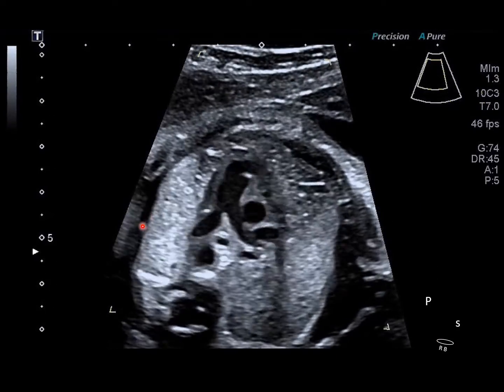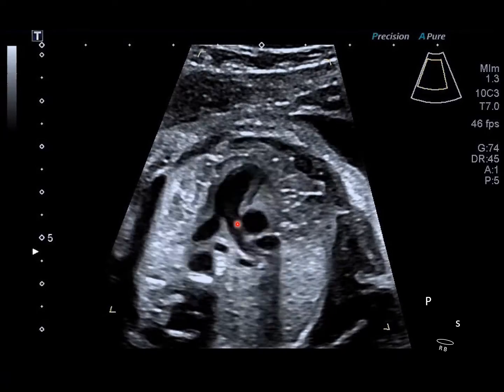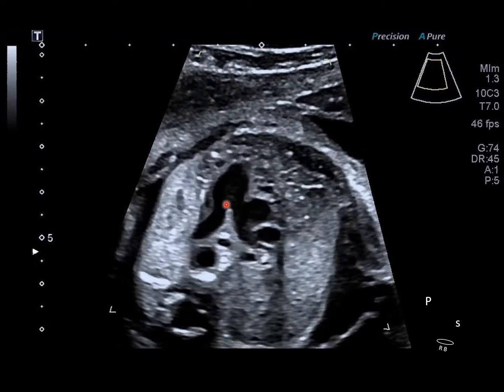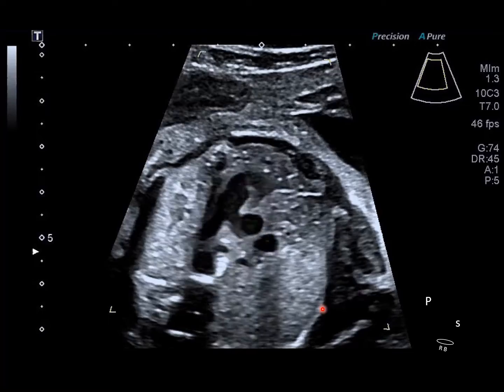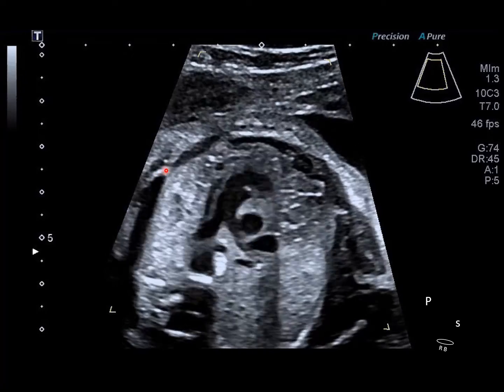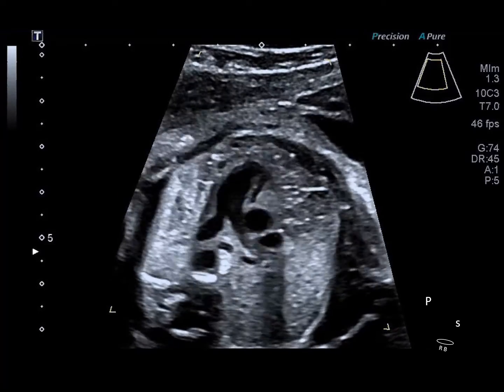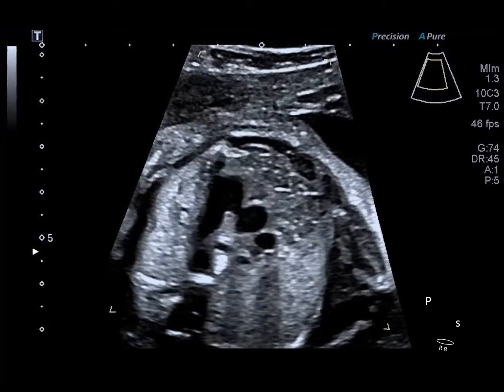And of course, from that upper chest view, you can rotate slightly to get these other views. This is the three-vessel view here with the SVC, aorta, and main pulmonary artery bifurcation of the pulmonary arteries here. This is slightly off. You see this rib has turned into sort of a half a rib, and there's another rib over here. Same thing on this side. You're seeing part of a rib here, since we've rotated ever so slightly. And this trick is just to watch the image as you're doing these slight rotations.